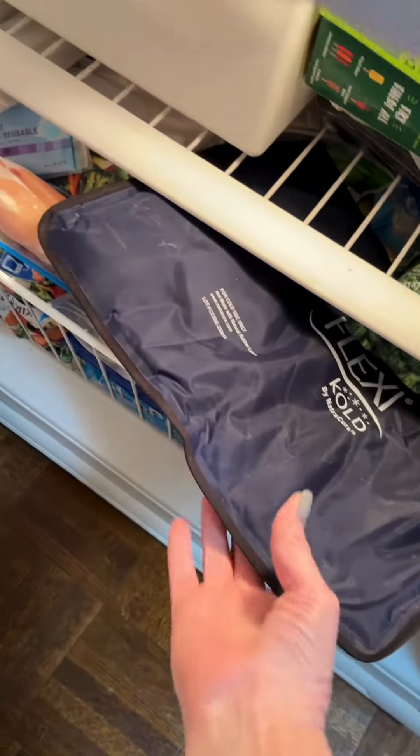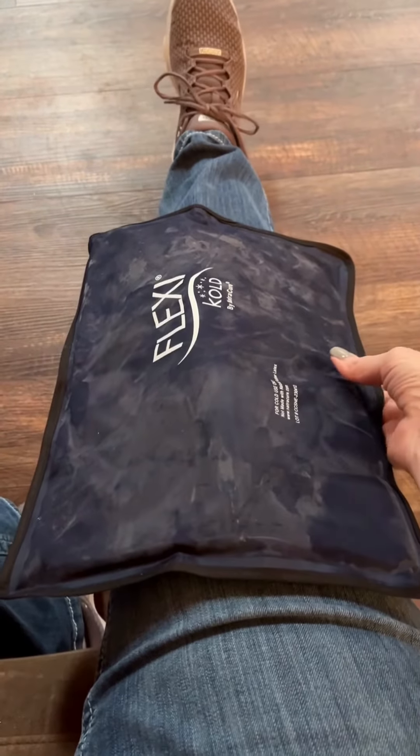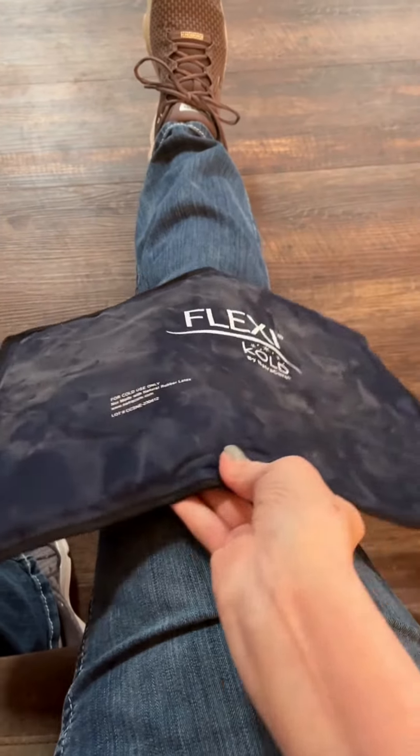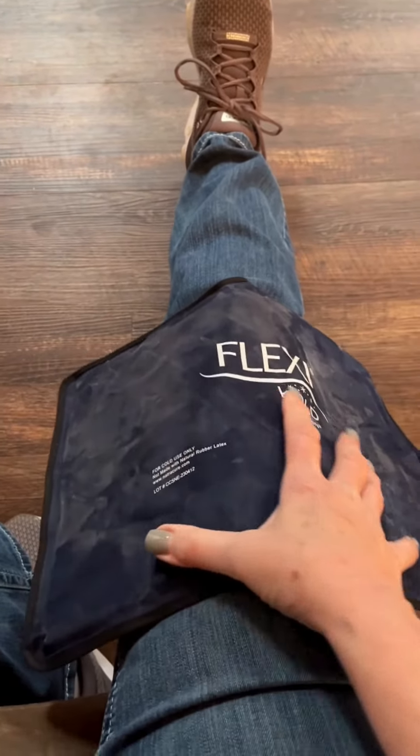Here you can see I'm taking it out of the freezer and it is still more flexible than most ice packs that are frozen. I'm demonstrating here on my knees so that you can see the size and the flexibility. I've been very pleased and would definitely purchase again.